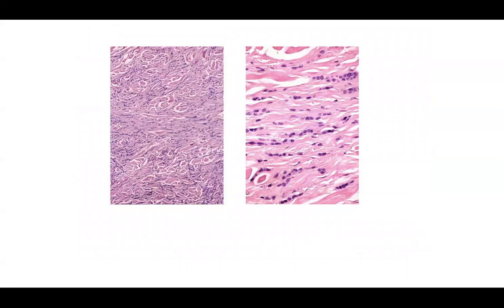Inflammatory or neoplastic? There's collagen trapping, which you get with certain neoplasms showing an interstitial growth pattern. The cells are lining up and growing interstitially between collagen bundles. When you see an interstitial growth pattern of cells that are monomorphic, round, and epithelioid — not your typical fibroblastic proliferation — consider metastatic breast carcinoma.